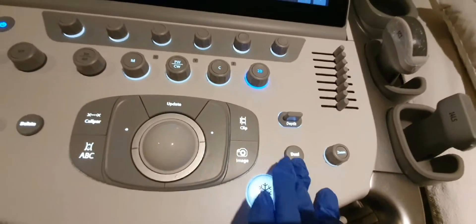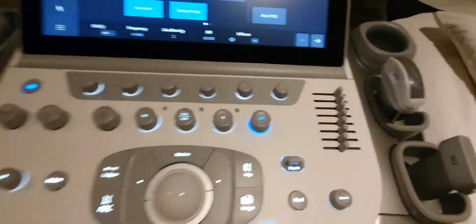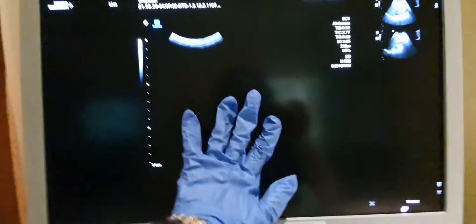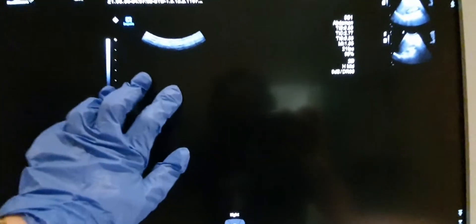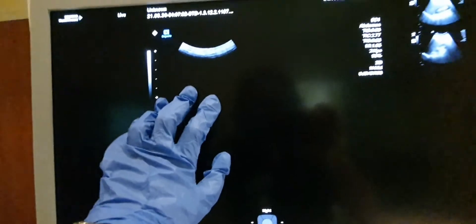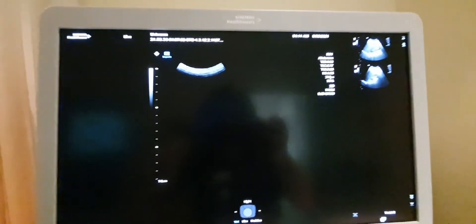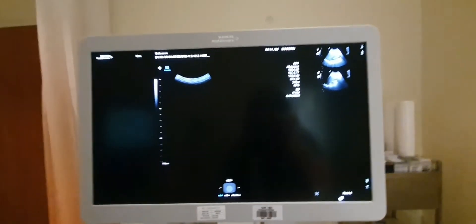Next is the dual button. Dual means you will have two images side by side. We usually use this for the urinary bladder, ovaries, spleen, and the hepatorenal and splenorenal views — just to compare the echogenicity of the spleen and the liver.